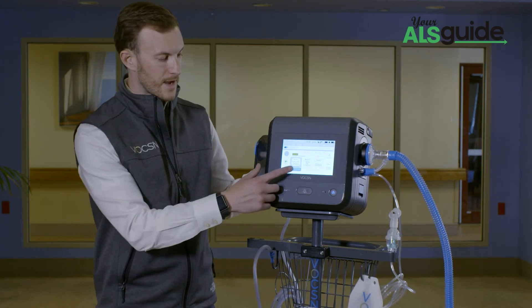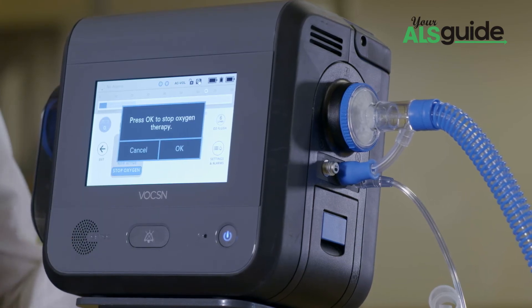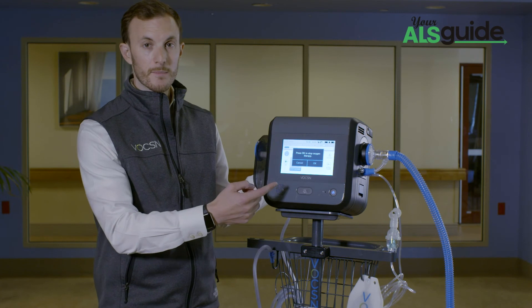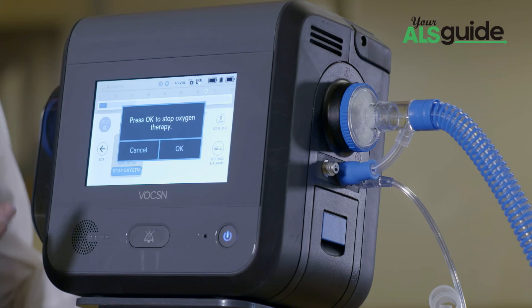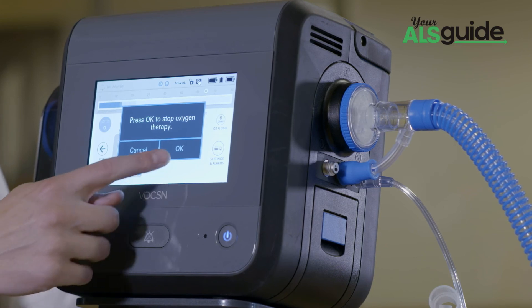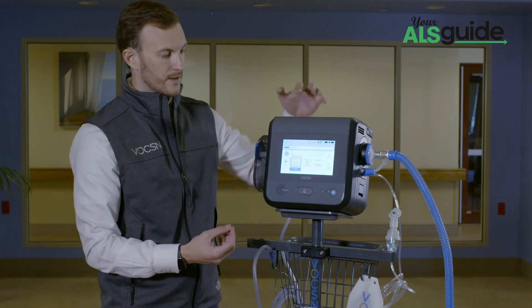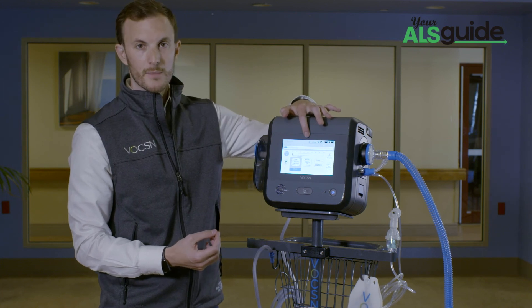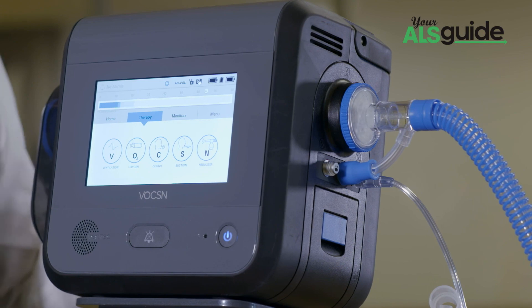I'm going to go ahead and stop oxygen by simply pressing the button. Voxxin is always going to walk me through what's going on. In this case, it serves me up a pop-up that says: press okay to stop oxygen therapy. I want to confirm that I want to do that, so I'm simply going to hit okay. You hear the oxygen concentrator turn off. Ventilation is always going on in the background. When in doubt, exit out. And I'm back to my main therapy screen.